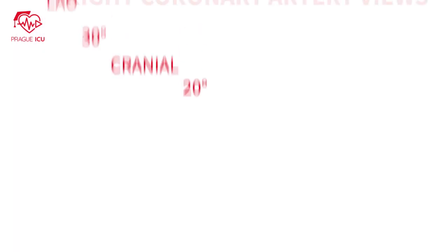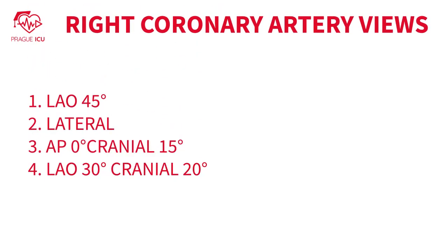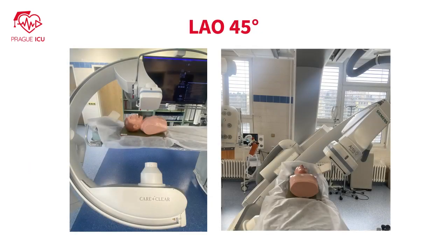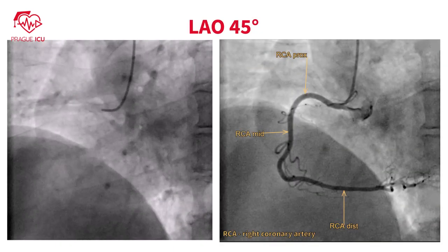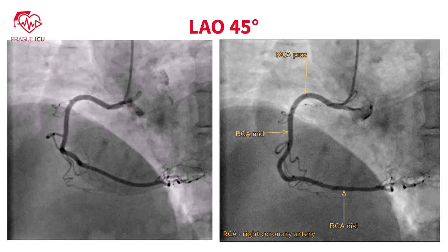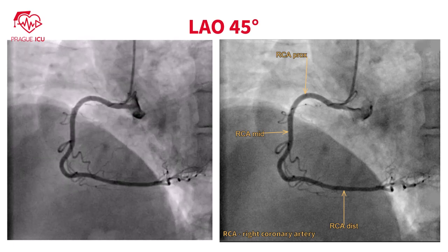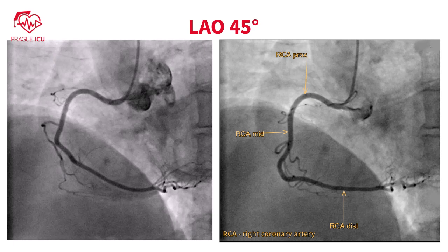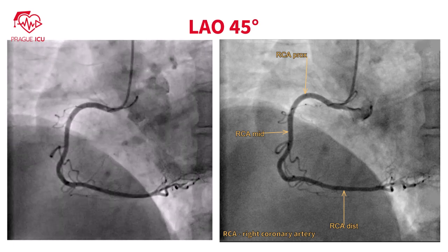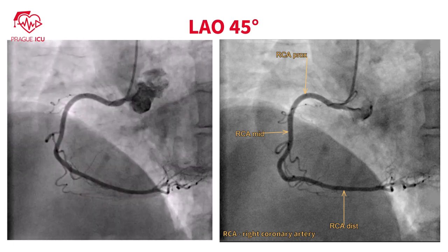The right coronary artery is typically imaged in 2 up to 4 angiography views. Prague ICU recommends the following ones. Left anterior oblique 45 degrees view usually shows the full length of the right coronary artery in a C shape. You can see the ostium of the right coronary artery and its proximal, mid, and distal parts.